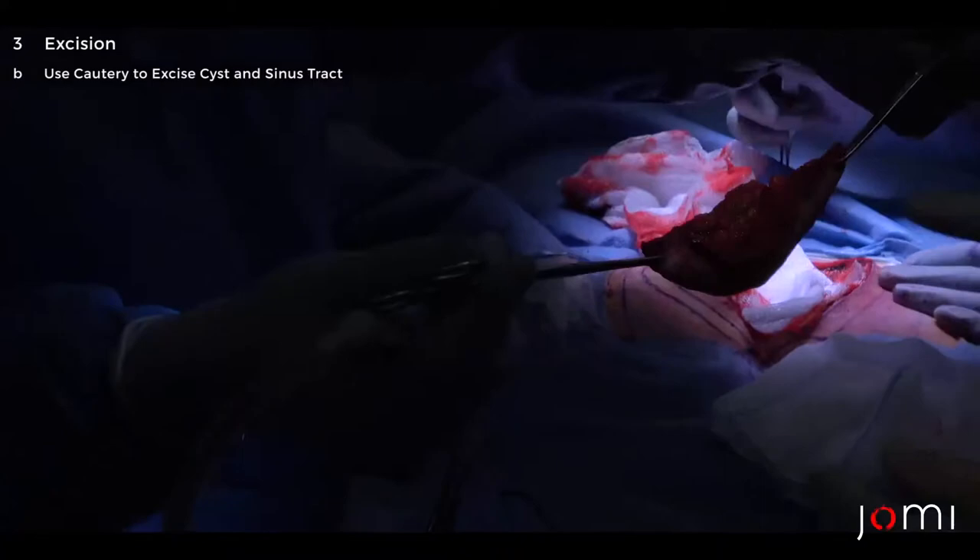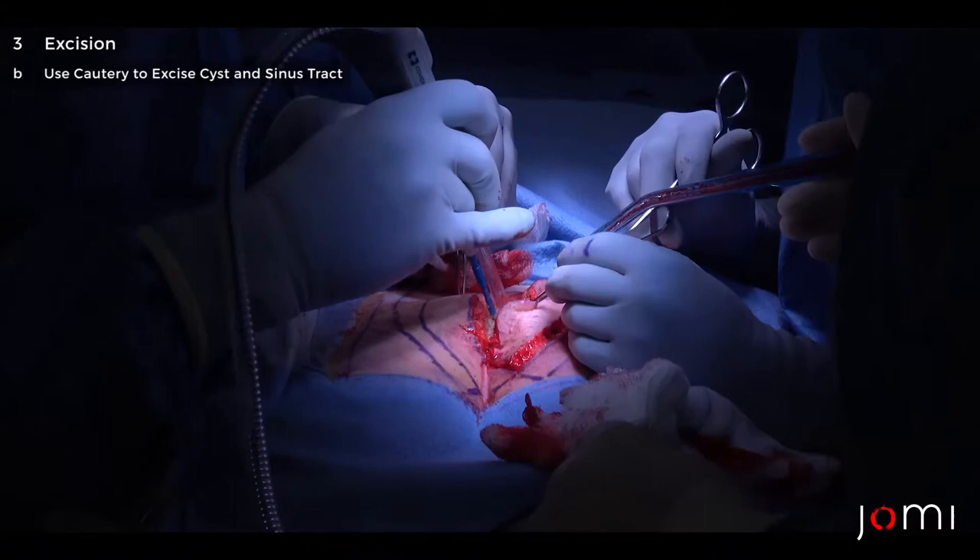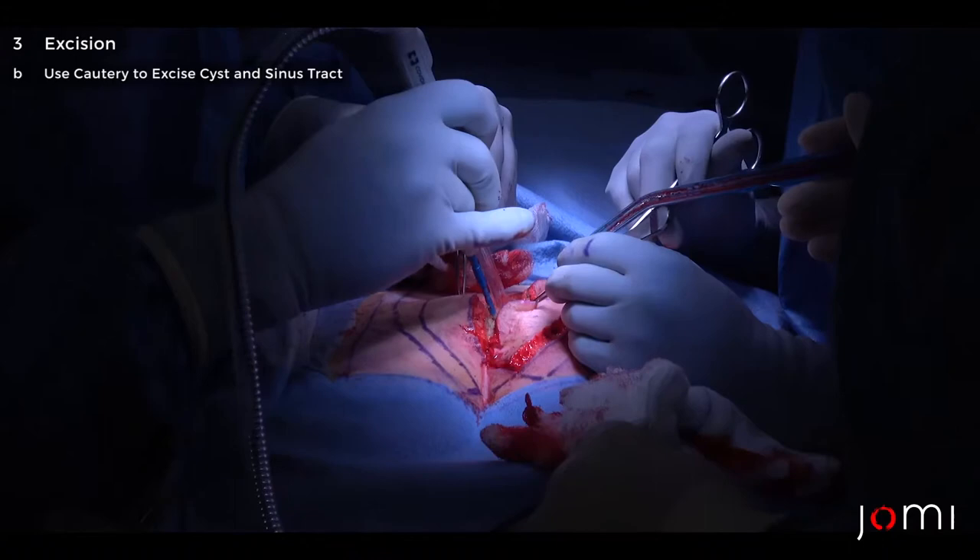In this case you can see that the tissue is a little bit white because there's some scar there. The sinus tract is actually a little bit off to the patient's left side of midline, so this is quite tricky.